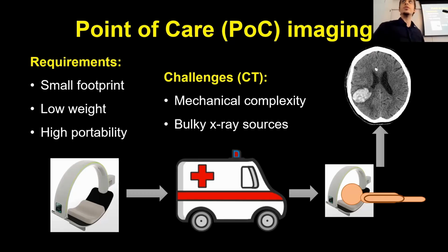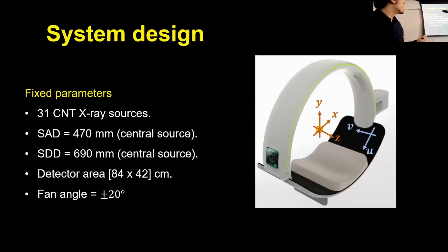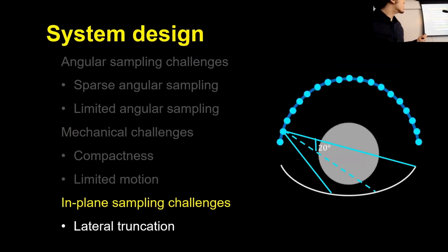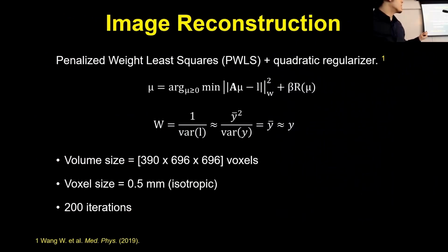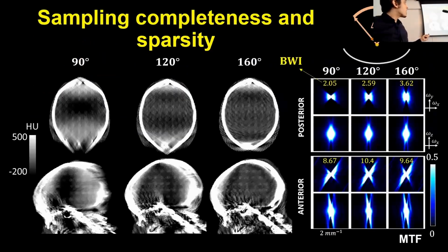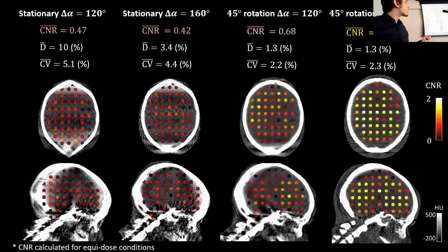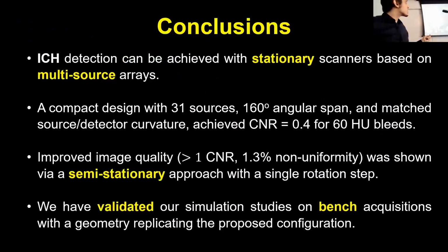The reconstruction we are proposing here uses a penalized weighted least squares algorithm. Let me go one second to the backup slides.